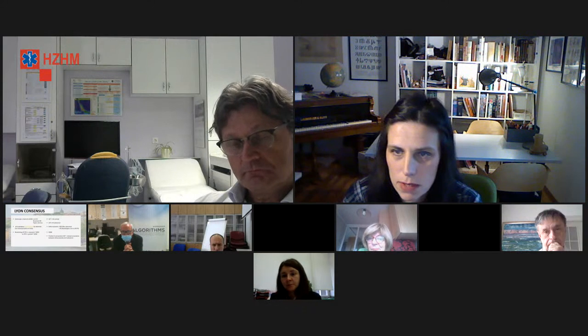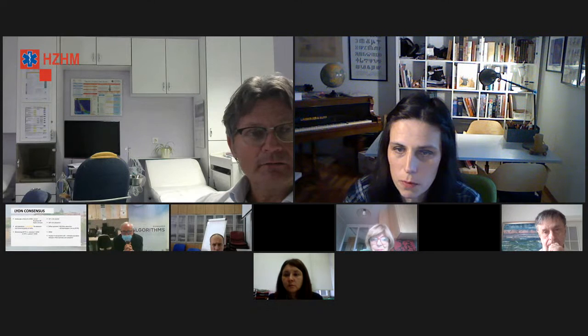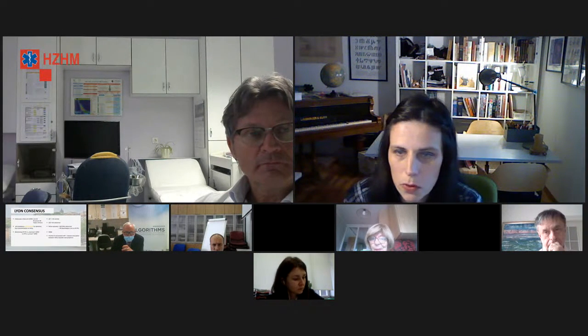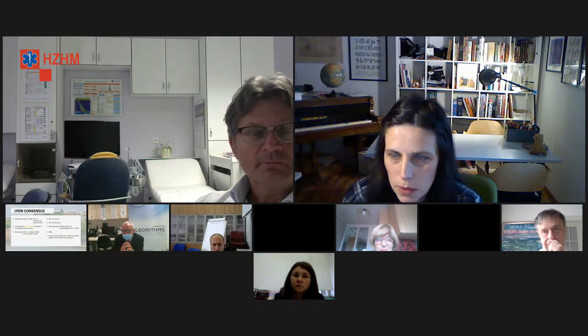Evo, Tomislav je stavio ovaj lionski konsenzus kojega se dotaknuo profesor Sifrim, koji je zapravo bio dio te grupacije koja je donijela konsenzus. Čisto sam ga stavila u nadi da ću se ponovno posvijestiti koje su te neke brojke koje su mi potrebne da bih nešto proglasila normalnim, nešto patološkim.